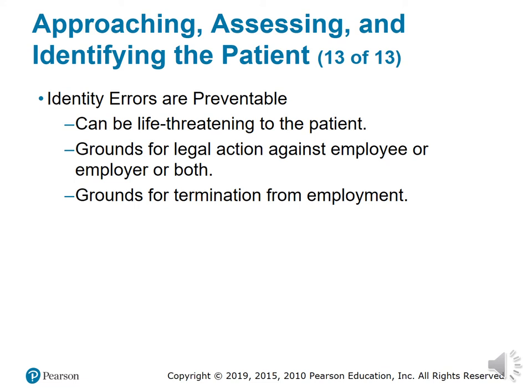Because again, performing venipuncture, this is what phlebotomy is. Performing venipuncture. All right? And all these things are fundamental to your success in doing this. You can't skip a step.